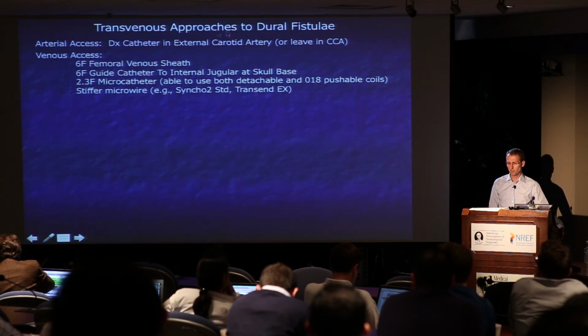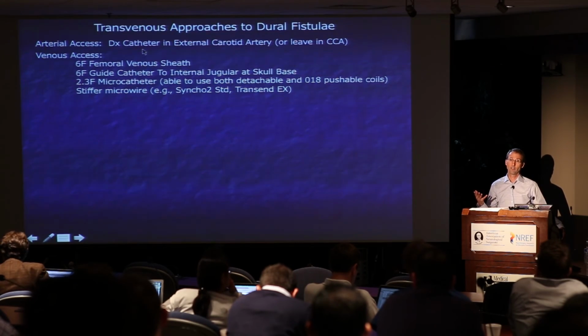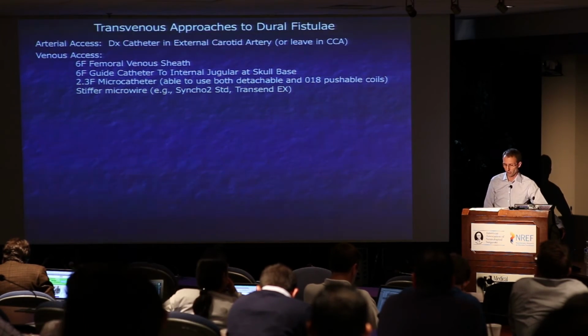So when I do a transvenous approach, I still do an arterial access to put a diagnostic catheter. That's obviously going to give you your information of where you are and where you're going.